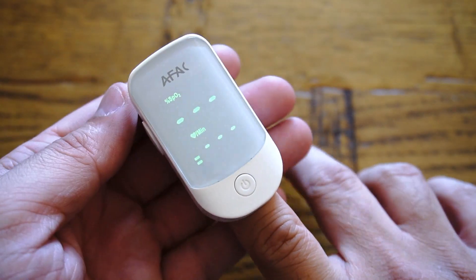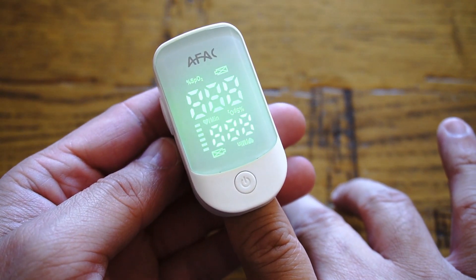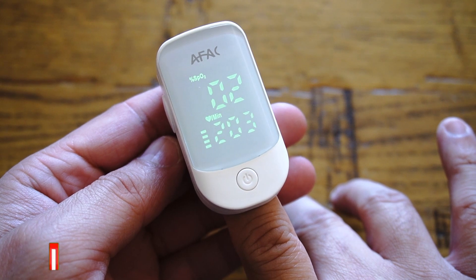Alongside your SpO2 reading, you can also measure your heart rate within 7 seconds — that's how quick it is.